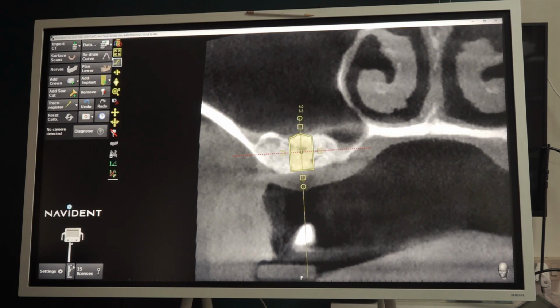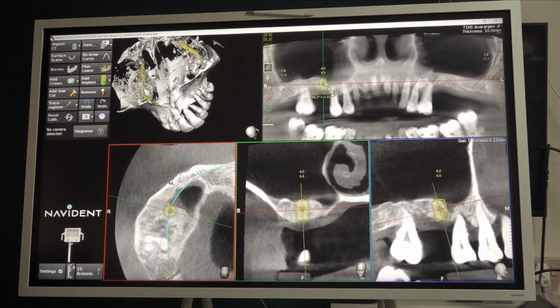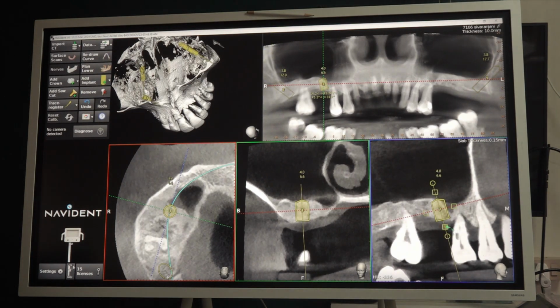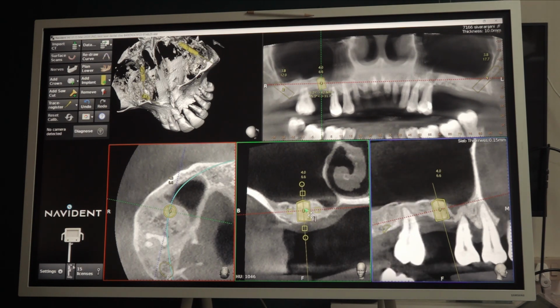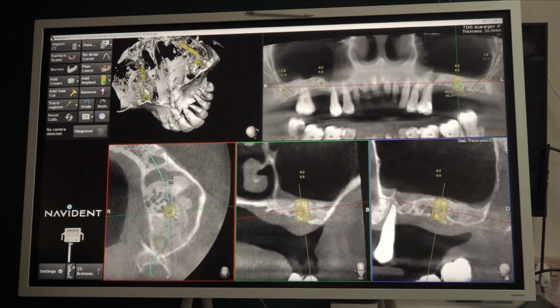Okay, we will see. Or else we can do some sinus lift with a mallet and place an 8 mm implant. We will see. So then organize the mallet also. Otherwise, we have to convert the 8 mm implant into a 6 or 7 mm implant and place it. But we have to place it because the bone is very less. You will see the left side also.